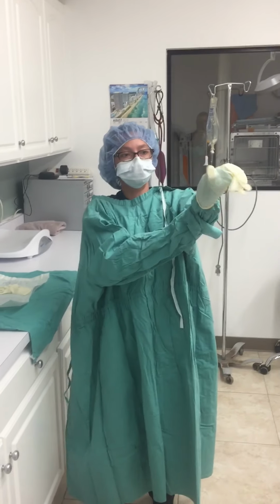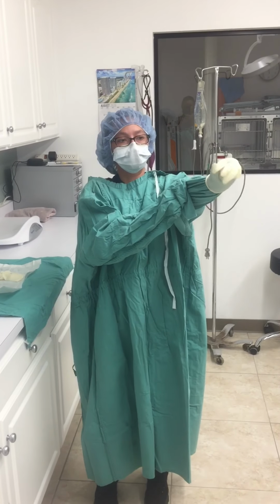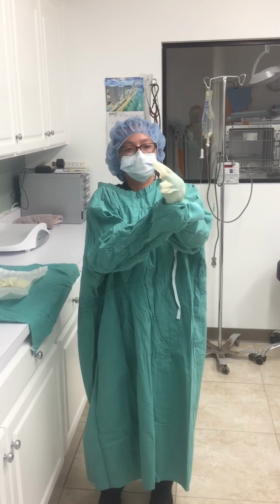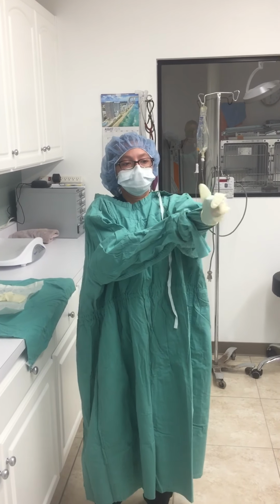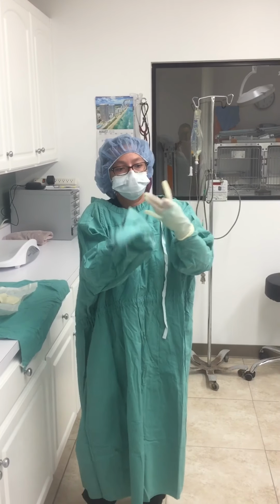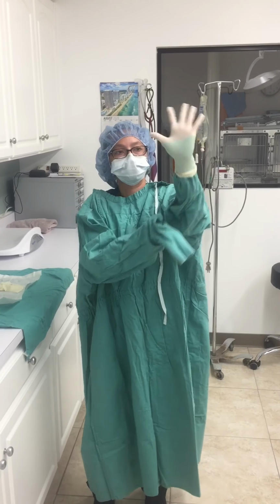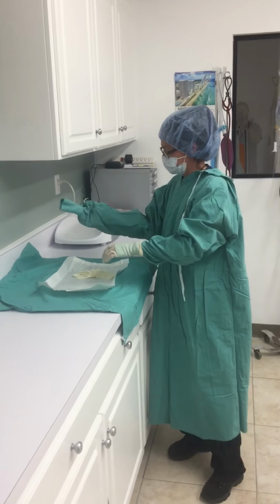Now you're going to take your sleeve, and now you can open your fingers up, and you're going to slightly tug on your sleeve, and your fingers should go in. This glove is very small, I should have used a little bit larger of a glove. There. And fingers and on. All right, sterile.